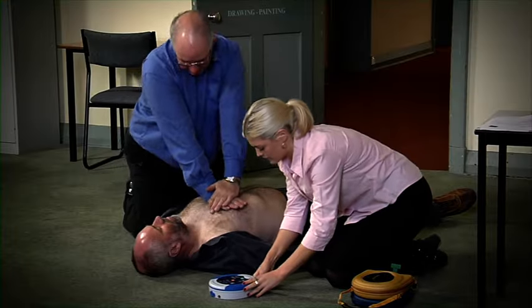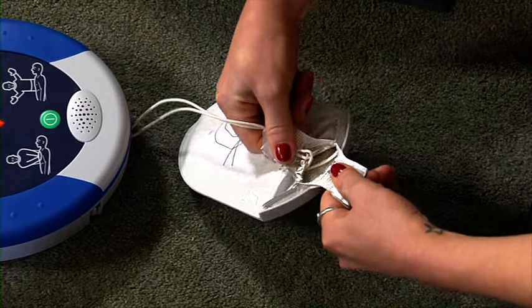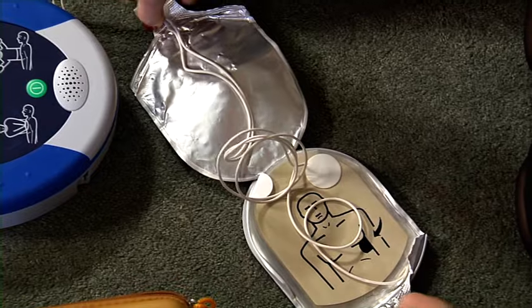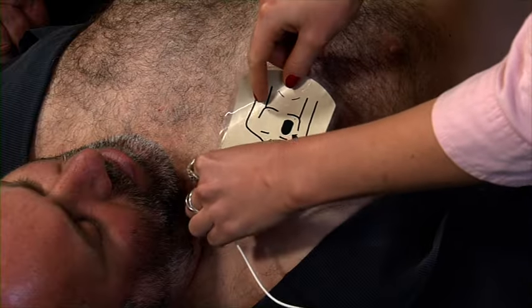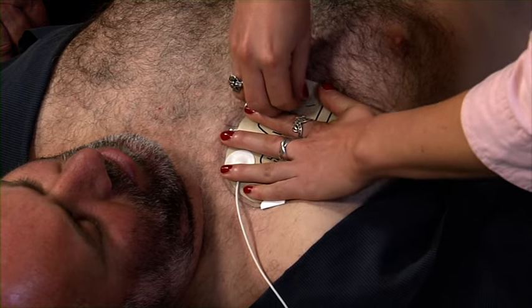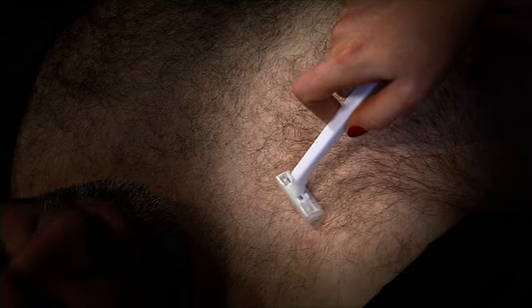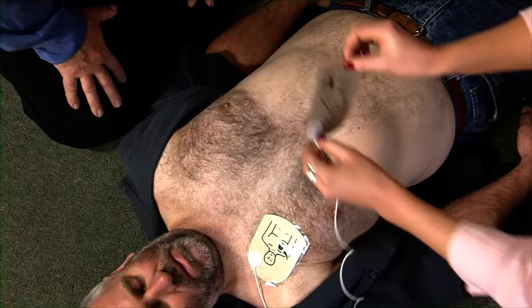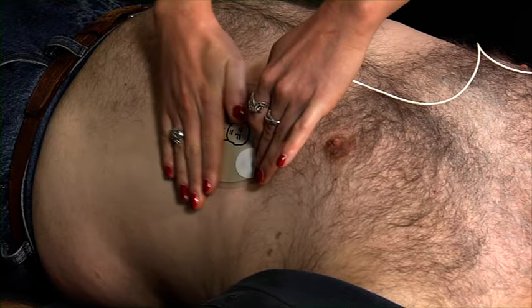Pull the green tab to remove pads. Peel pads from liner. Apply pads to the patient's bare chest as shown in the picture. Press pads firmly to the patient's bare skin. Shave hair from the patient's chest if necessary. Ensure that it is dry and all undergarments have been removed.